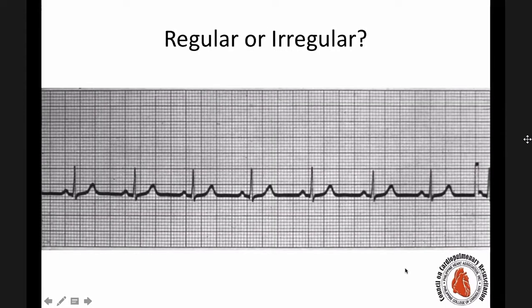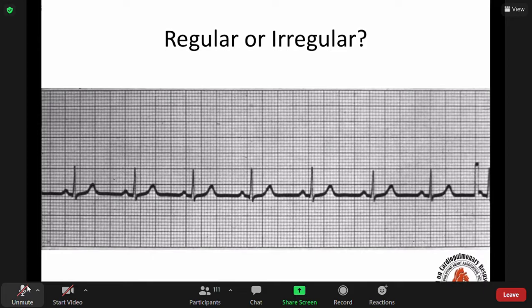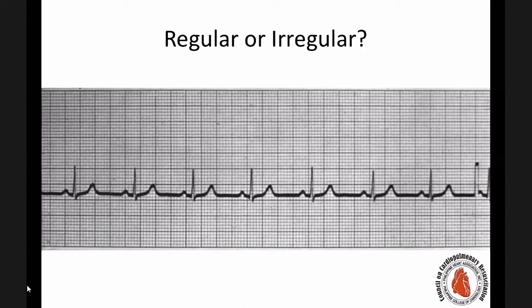So let's try to test. Is this regular or irregular? Ano sa tingin nyo? Anybody? For participation? Visually lang, tingin nyo. Is it regular or irregular? Meaning the R2R interval, is it the same or not the same? Regular. It's regular. So this is the time that you have to be visually exercising to look at an ECG if it's regular or irregular. Okay? Next.